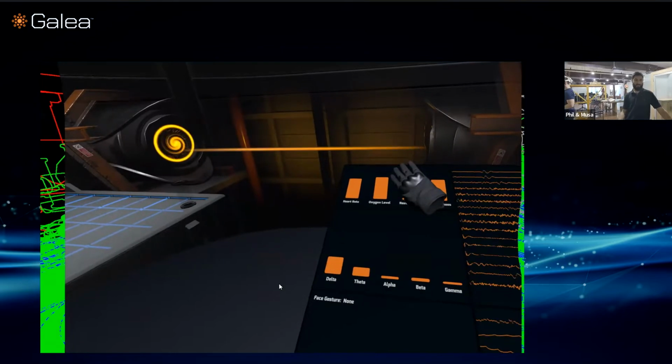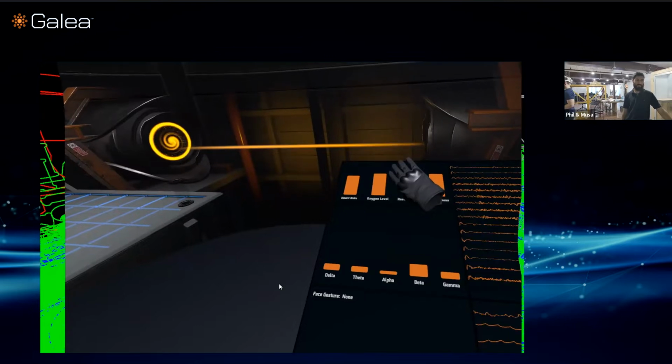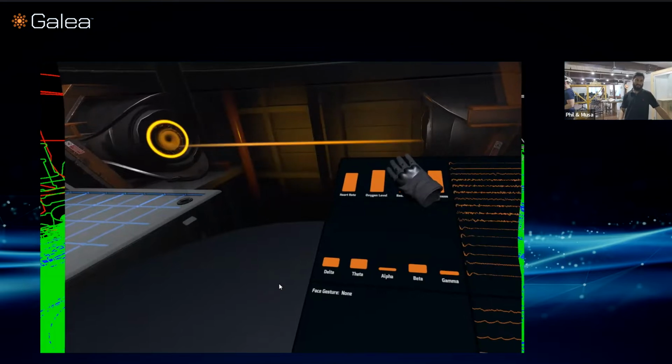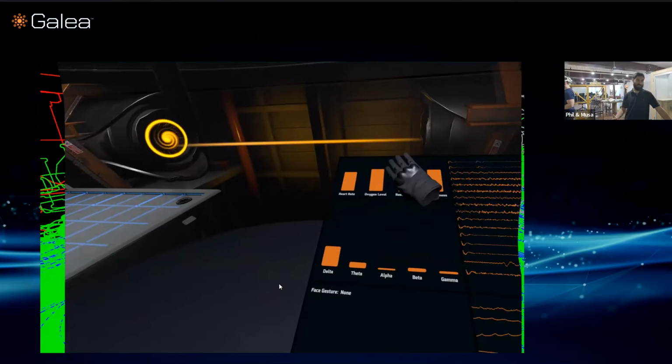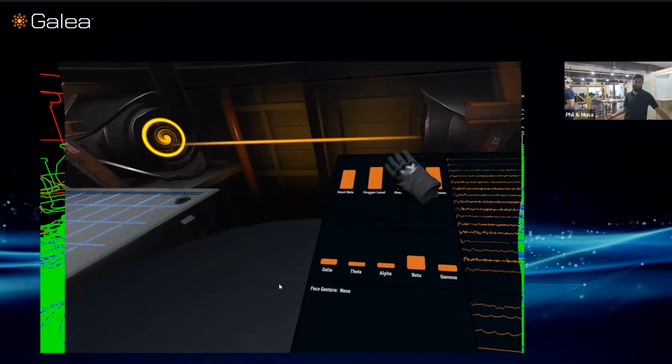oxygen level. It's going to go from saturated, which is 100%, down to around 80 and then 70% the longer he holds his breath, because the blood will lose oxygenation as your body consumes oxygen, and he's not replacing it because he's holding his breath. So you should see a decline in both his heart rate and his oxygen level as he holds his breath.